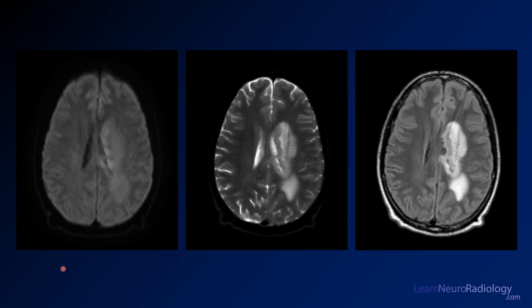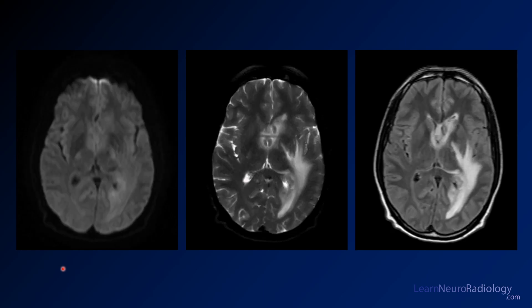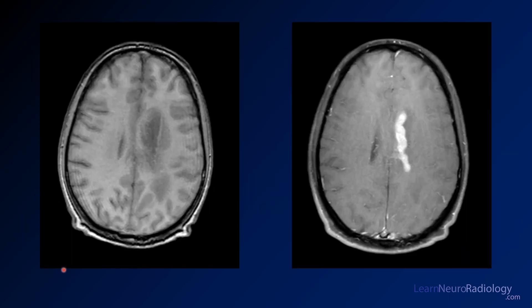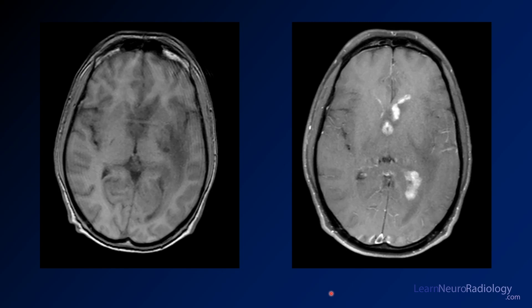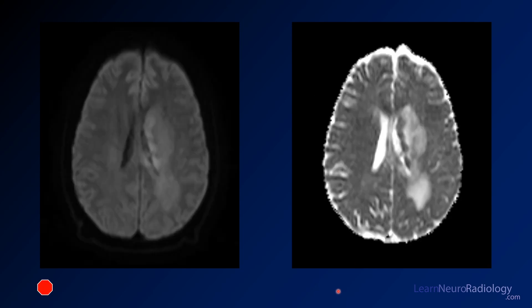Here we have a few axial images from an MRI of the brain, and now the same images from a little bit lower. Here's a magnified T1 pre-contrast and post-contrast images, and again going a little bit lower to that same level — pre and post-contrast again. Here I've just placed your DWI against your ADC for that higher level.